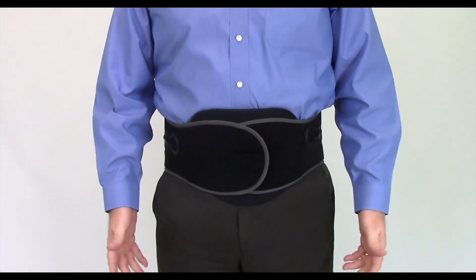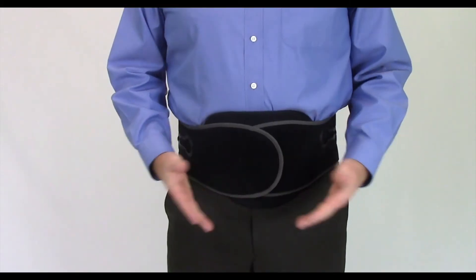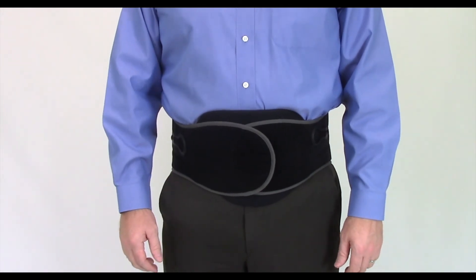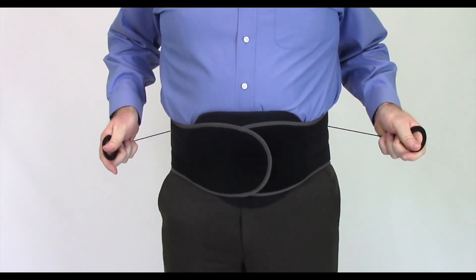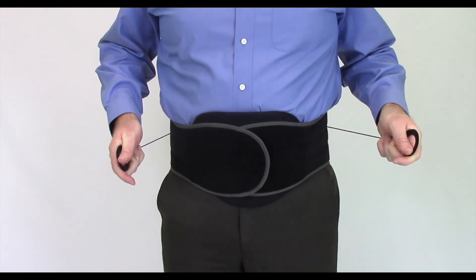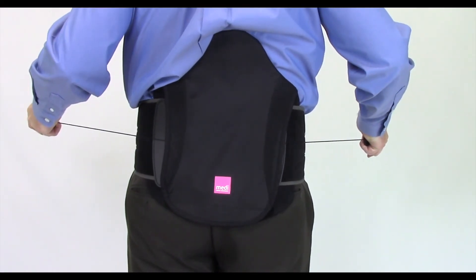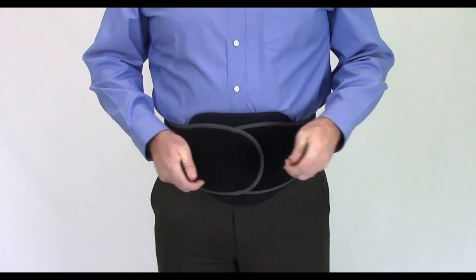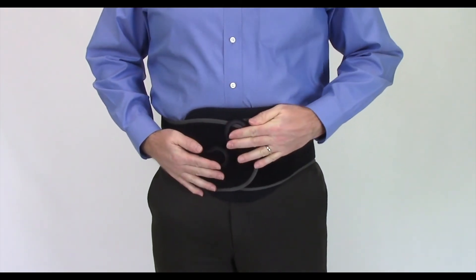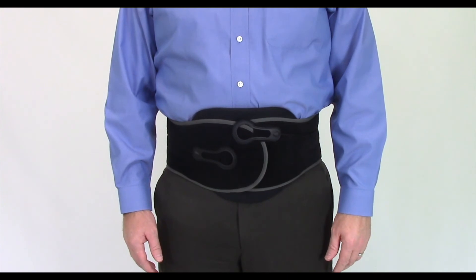If further size adjustment is necessary, remove the device and repeat the sizing instructions as necessary to ensure a proper fit. Now that the device is comfortably in place, you can adjust the support of the device by using the O-ring cinch straps. Independently pull the left and right O-rings to tighten the pulley cord frames as needed. Once the tension feels right, fasten the O-rings back onto the wrap panels. This will lock the frame in place. The O-rings can be adjusted anytime, as needed, for comfort and support.